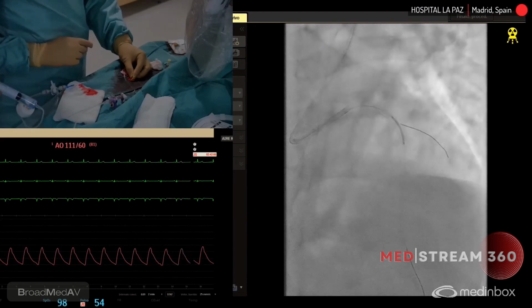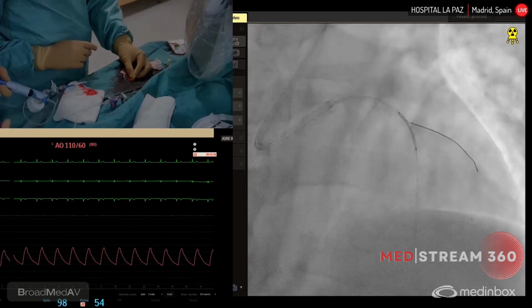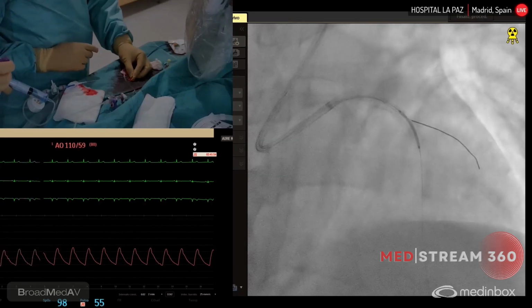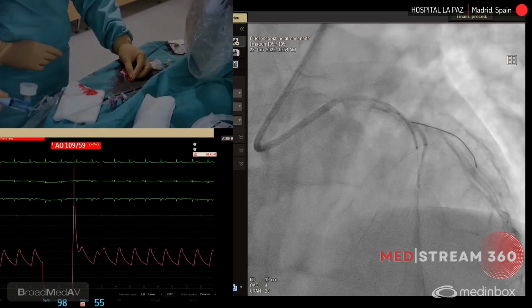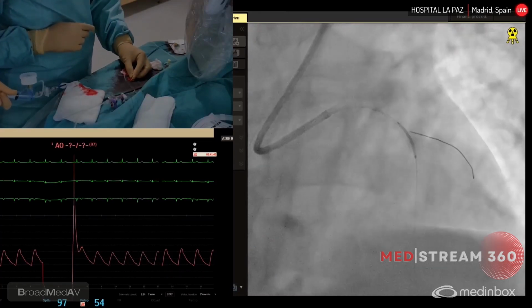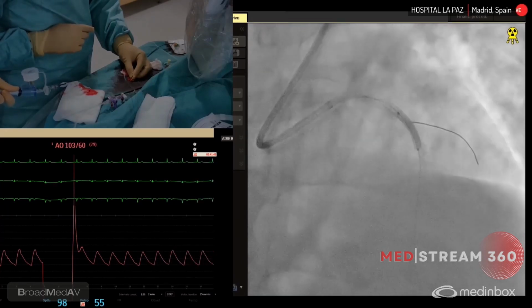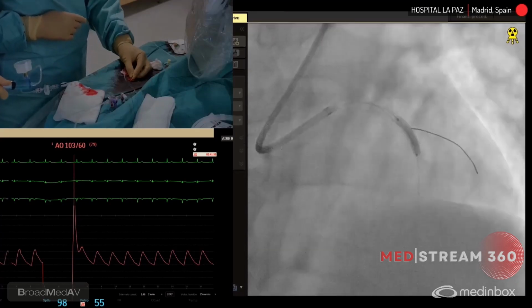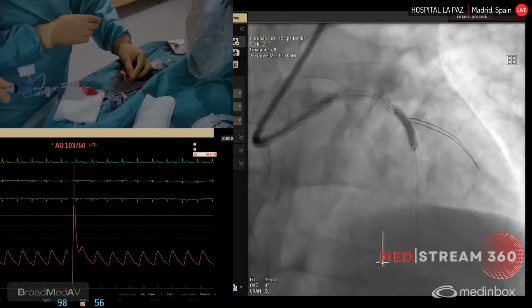Okay. Let's go there. 18. 18. Okay. Expansion is quite good. Okay. Go down. Okay. So we need to do a POT.